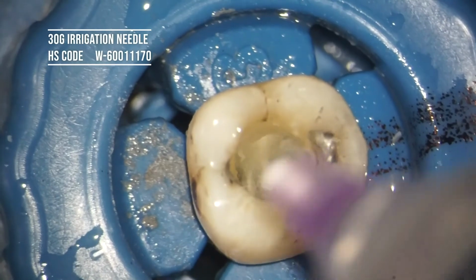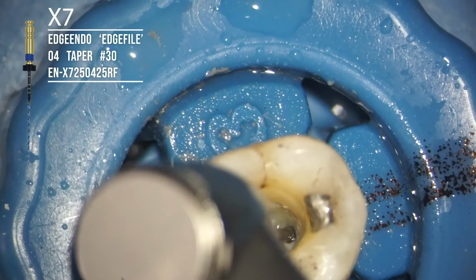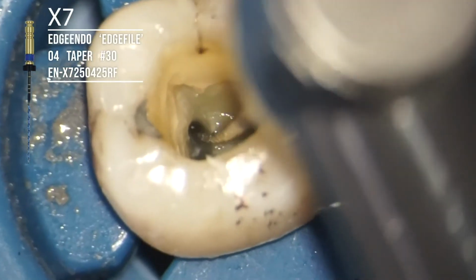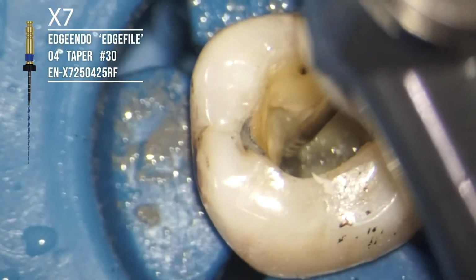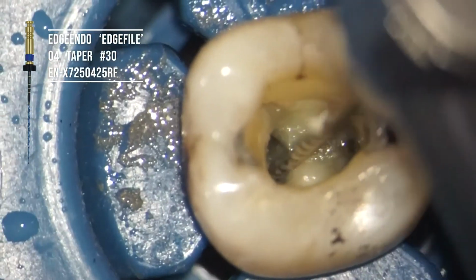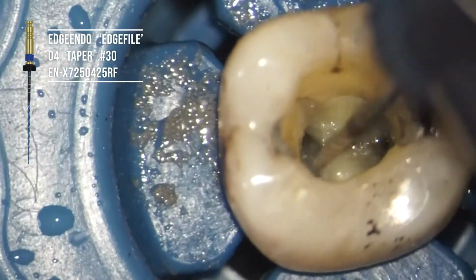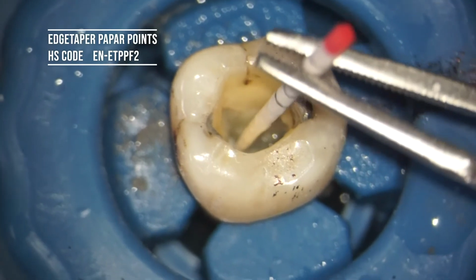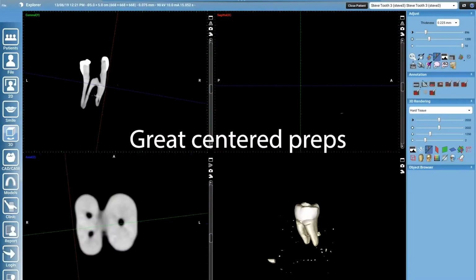Size 30 in the distal root, and size 30 in the mesial, mesiobuccal and mesiolingual. And these just slide right around that curvature in both the buccal and the lingual. And obviously this is sped up just to save time by about 4 times. So it's looking like I rushed it, and that's because I did. And then irrigate, irrigate, paper point, and finish. Notice in that previous picture you can see a soffit. This is current thinking that I don't have time to go over in this prep.